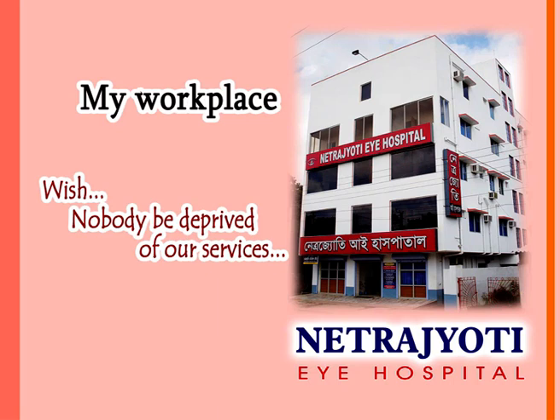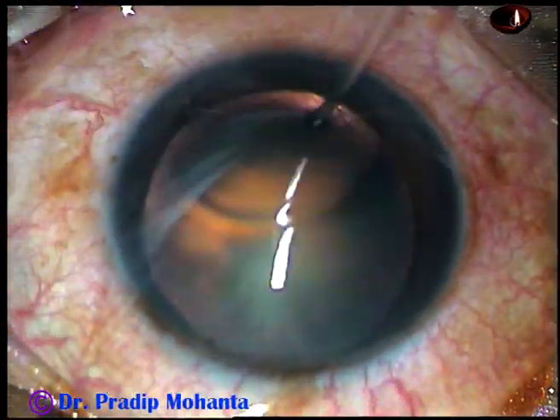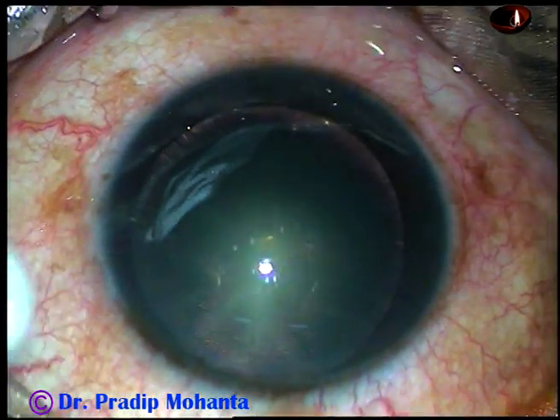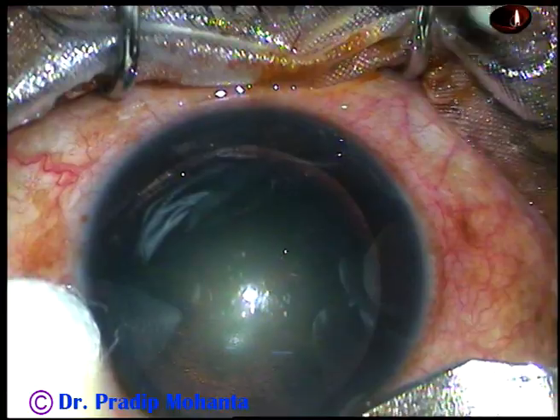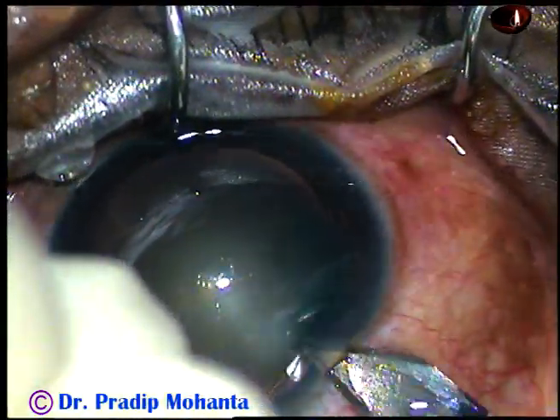Friends, welcome to my workplace at Ranak Heart, West Bengal, India. This is a totally unedited recording of phacoemulsification of a soft cataract. Nucleus sclerosis in this case is grade 1 plus or grade 2. In this case, I am going to employ the carousel technique of nucleus management.